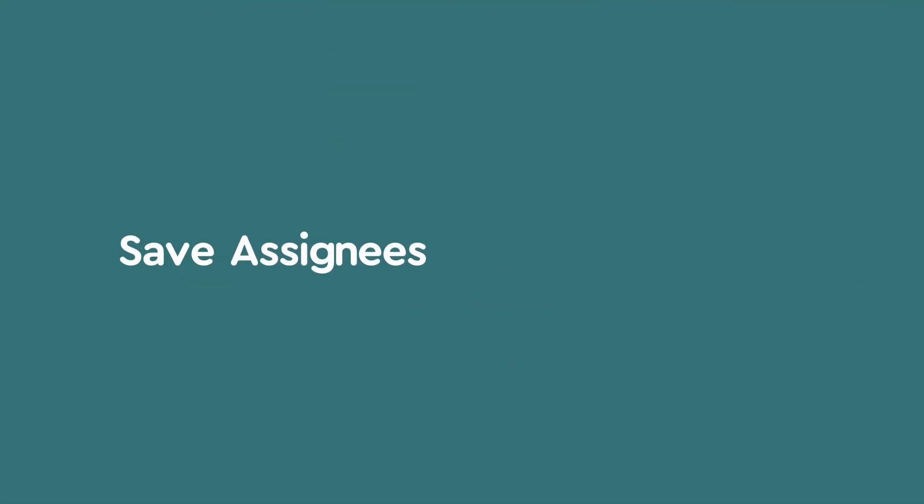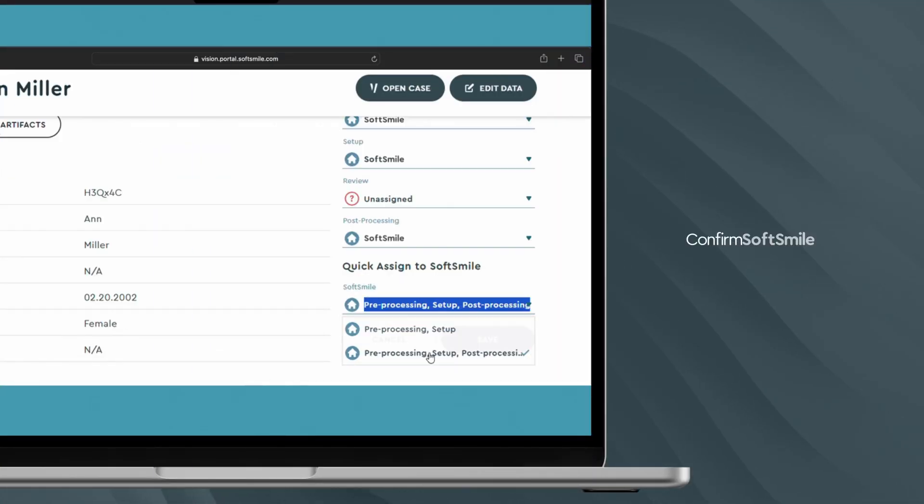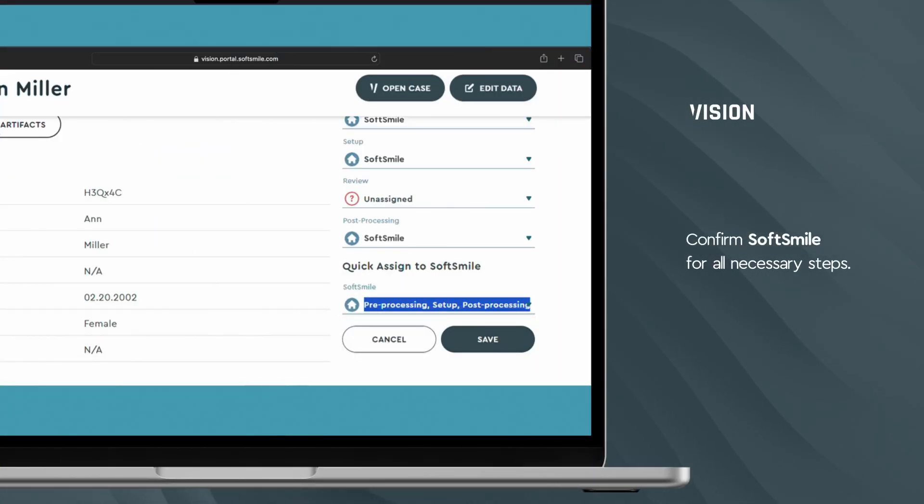After setting SoftSmile as the assignee for the necessary steps, make sure to save your changes. It's that simple.